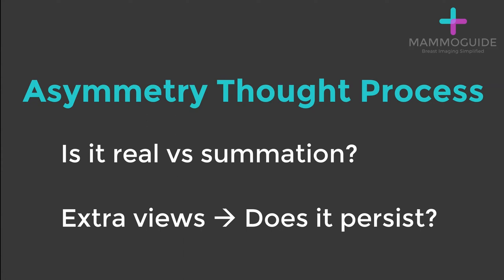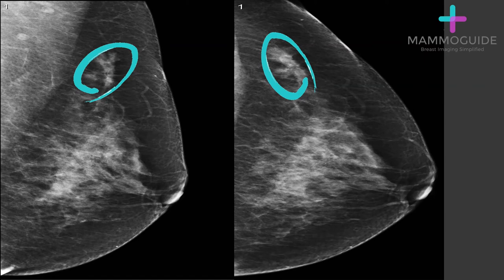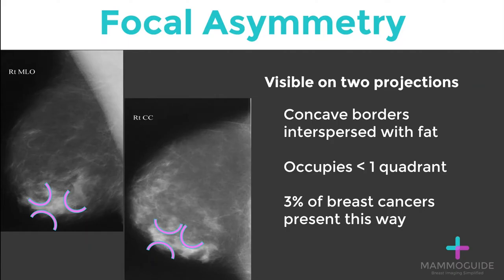The thought process when evaluating an asymmetry is: first, is it a real finding or just summation artifact? This can be sorted out with extra views — does the abnormality persist? Standard craniocaudal and medial lateral oblique views of the left breast show a focal asymmetry in the upper outer left breast.